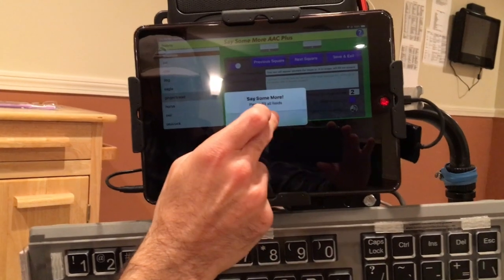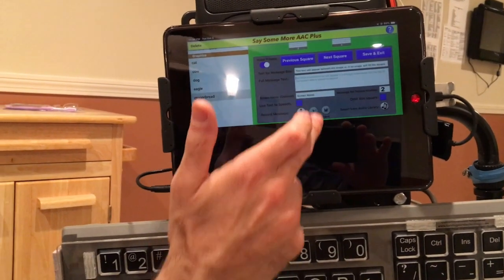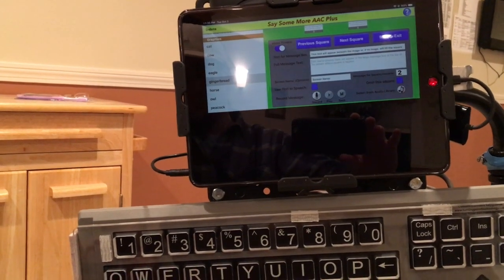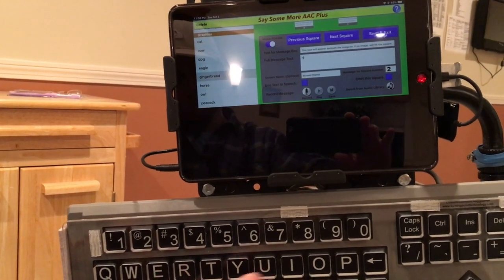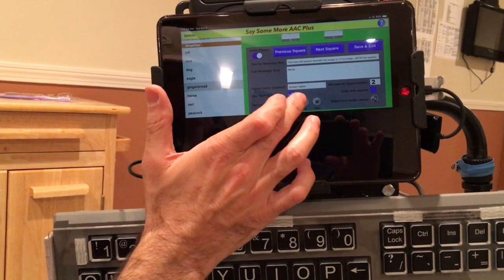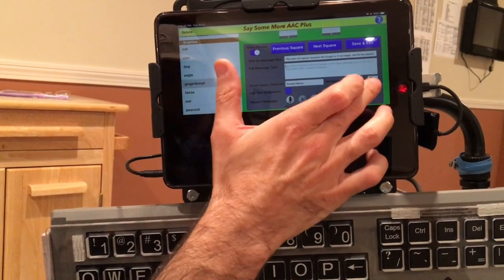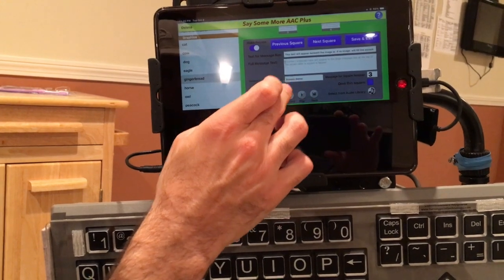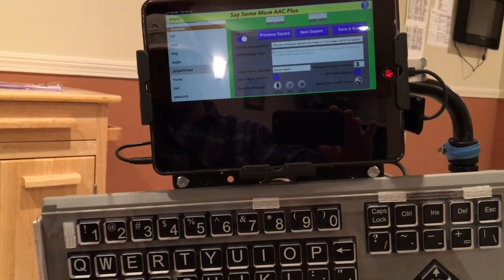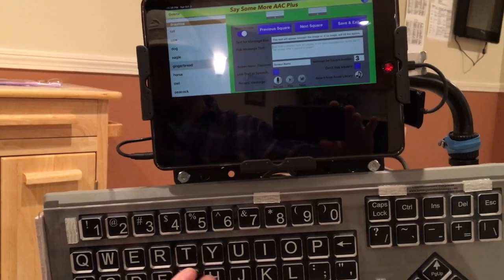It's going to make me do 2, too. Again, this editing interface needs some updating. This one is going to be a horse. Text to speech. We're going to add that icon later. And the next square, now we're on 3. This one was the gingerbread house. So gingerbread.